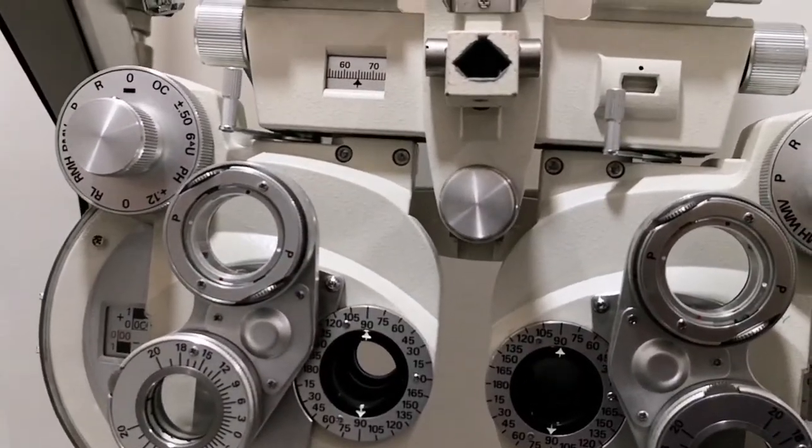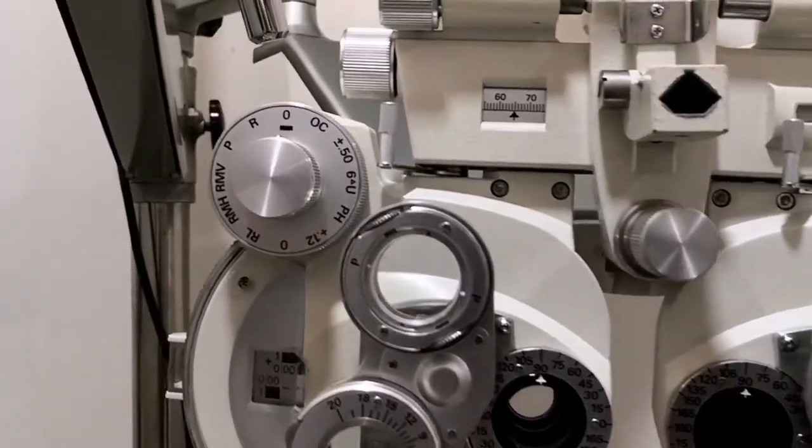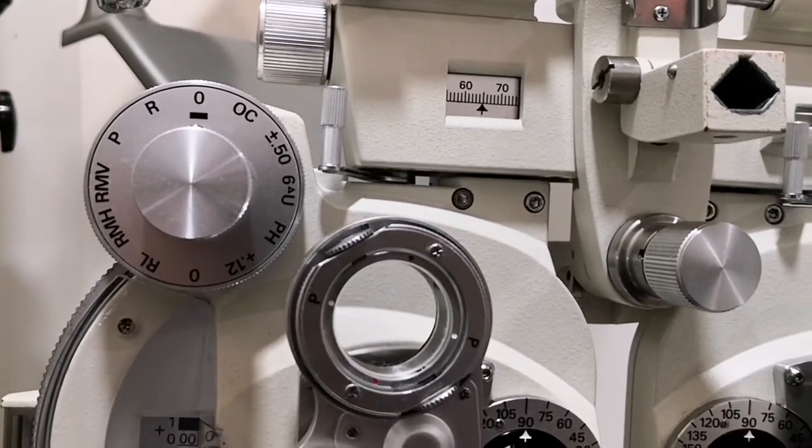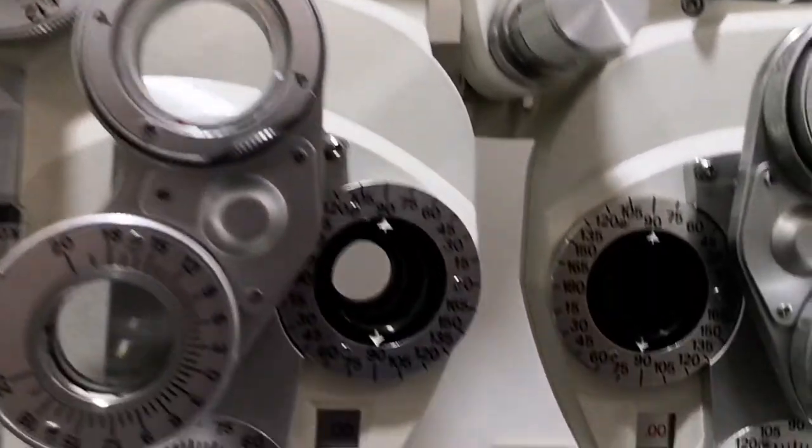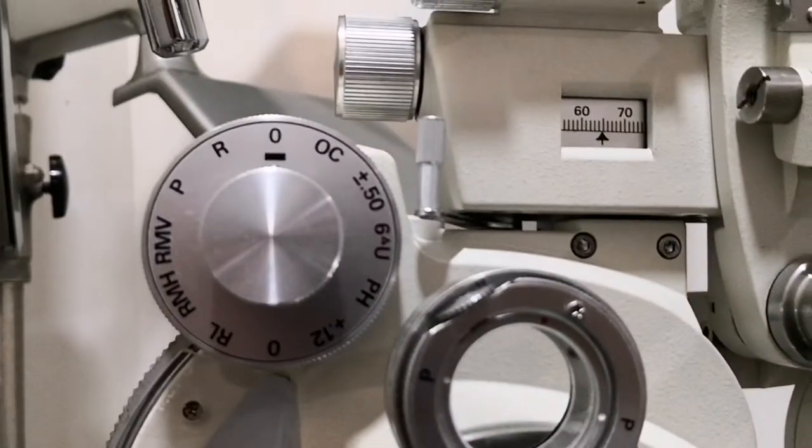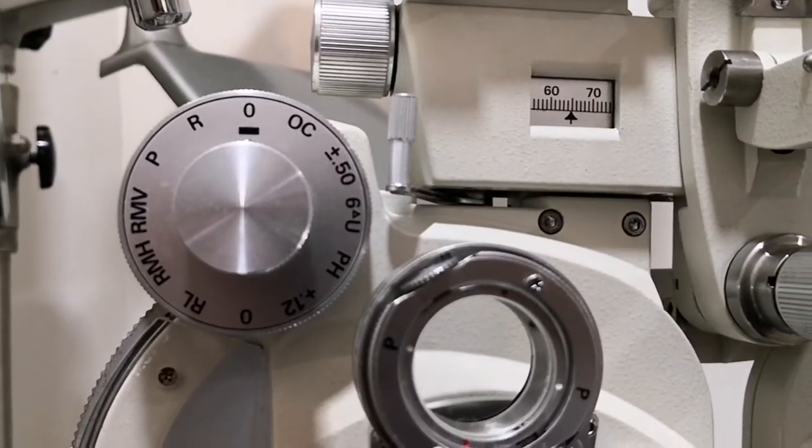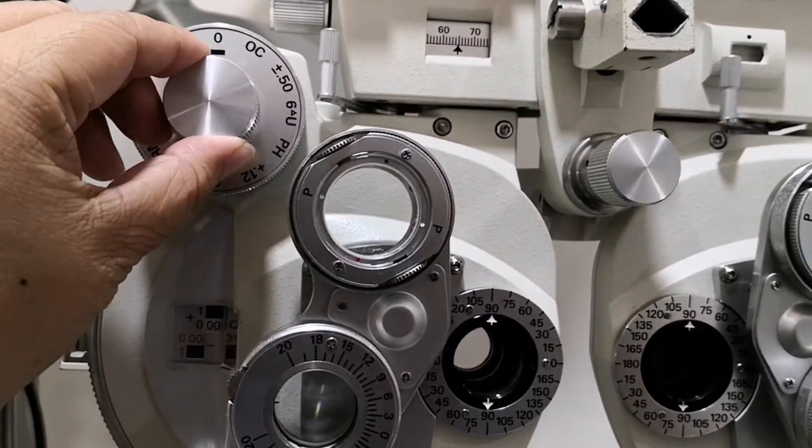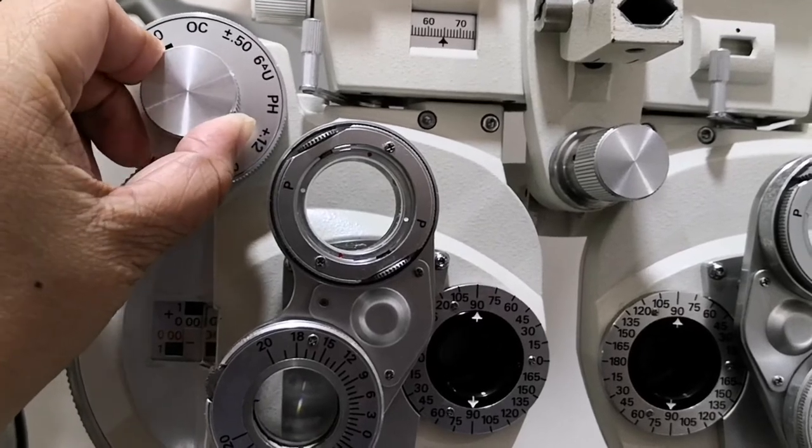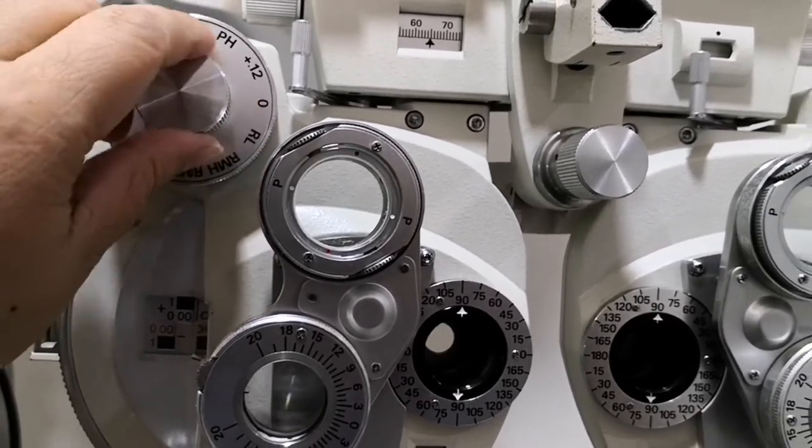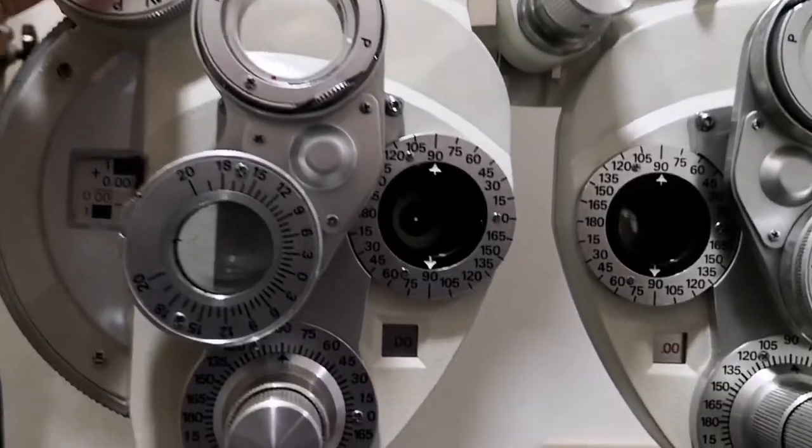The next part of the phoroptor is the auxiliary lens or aperture control. The aperture control determines what the patient looks through when behind the phoroptor. It consists of O for open, OC for occlude, and PH for pinhole.